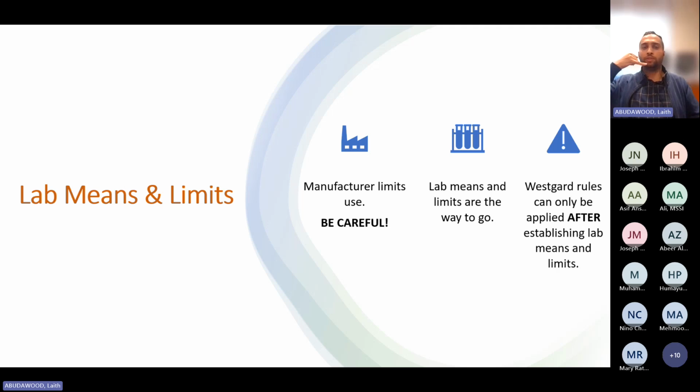The customer will call you up, your analyzer is reading on the lower side. Come and fix it. But there is actually really no problem with the analyzer. But then you don't have the target for Compact Max in the sheet. So how would you know? This is where externalized IQC, or comparing to other labs, comes in very handy. It becomes very useful. I will look at how much my Compact Max for this lot was reading in other labs.